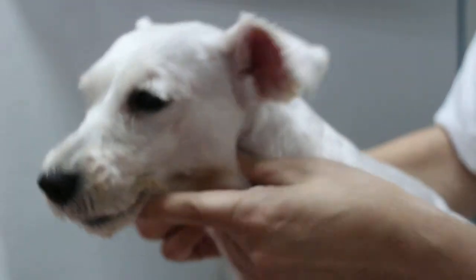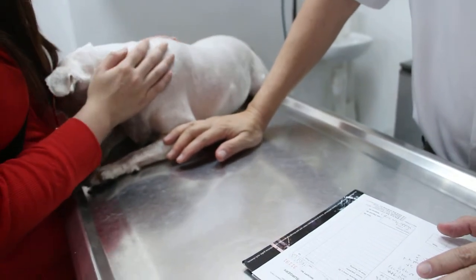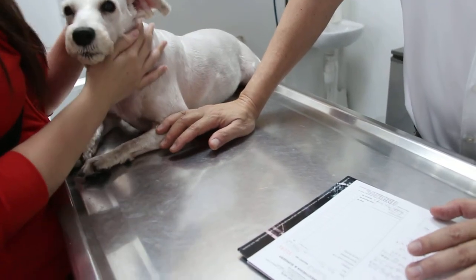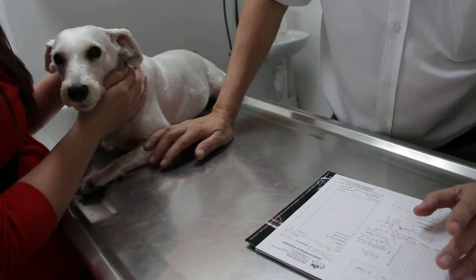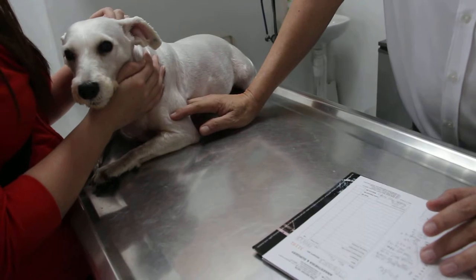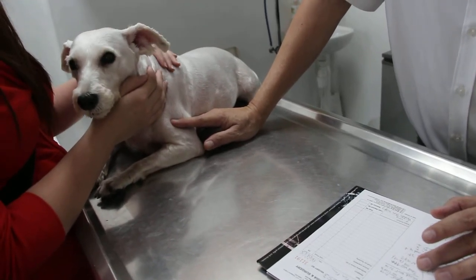So now I will go through the blood test and urine test. From the blood test and urine test taken 7 days ago on this dog with polydipsia and polyuria: the urine test shows pH is 7, SG 1.008, and no crystals. No crystals does not mean there are no urinary stones, as you can feel them. The blood test shows very high white blood cells and very high neutrophils, indicating that the dog had a bacterial infection of the blood last week.